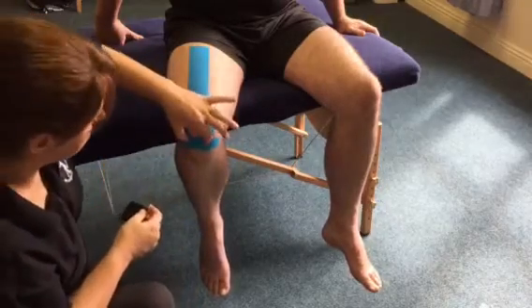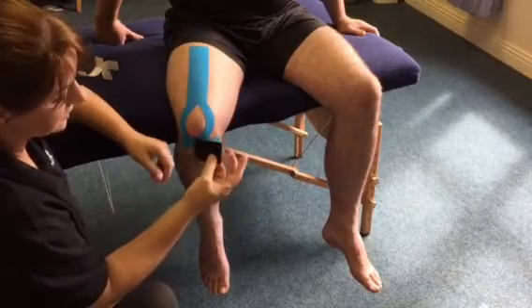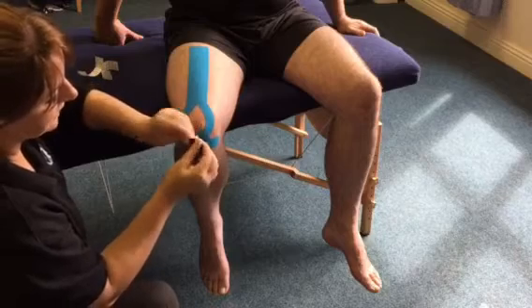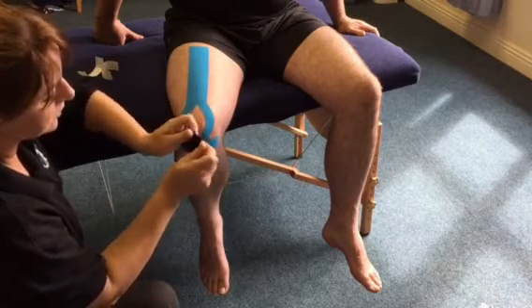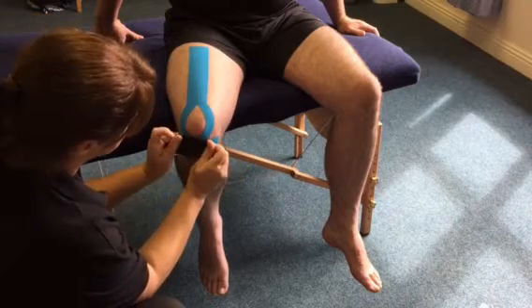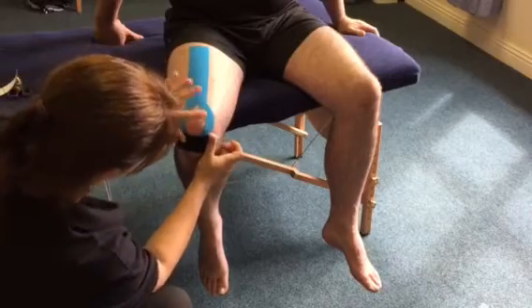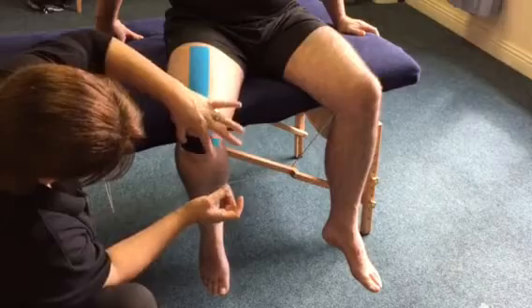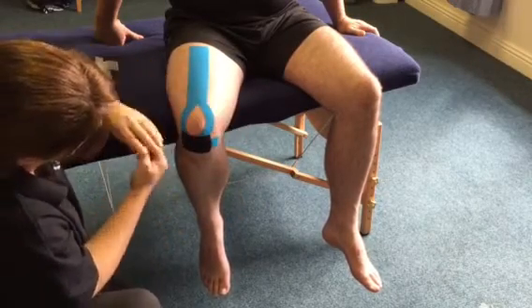If they still feel pain after that, you could apply another strip, or what I'm going to do is apply a short pain-relieving strip. For this one I'll tear it right down the middle, pull back the two pieces of paper so you have something to hold on to, then stretch it to the max — 100 percent — and ease back off just a little bit to about 90 percent stretch, right over that point of pain. No stretch ever on either end.